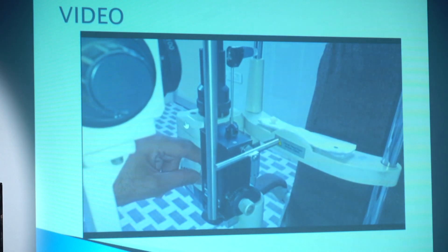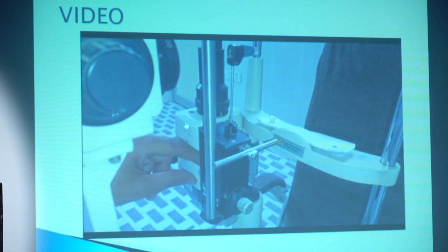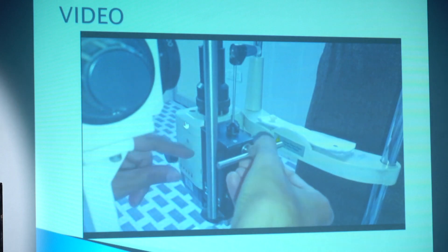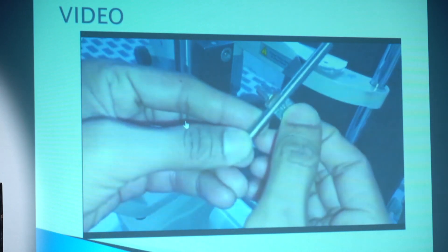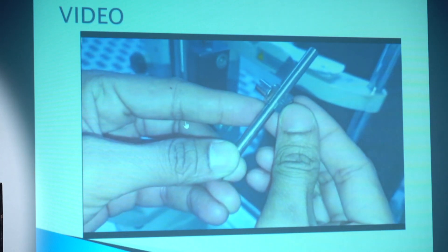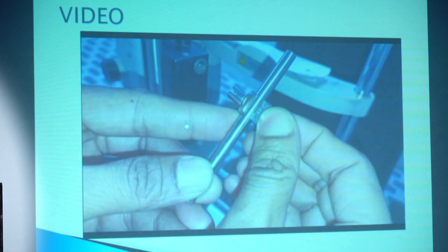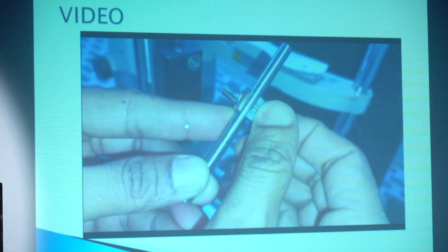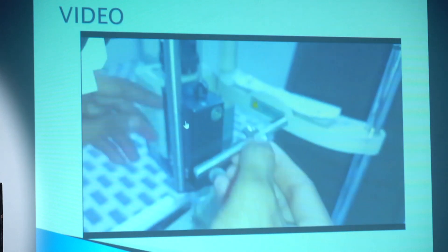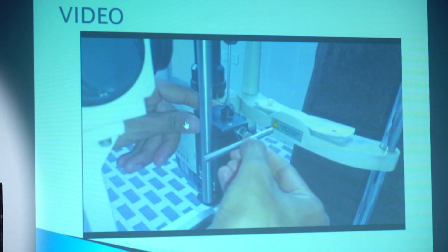Now move to position 2. You can see this Goldmann applanation tonometer has an error at this position, so I should send it to the manufacturer. We repeat the same check at position 2 — if the reading is within plus or minus 2, it is acceptable. Beyond that margin, it indicates an error and recalibration is needed.